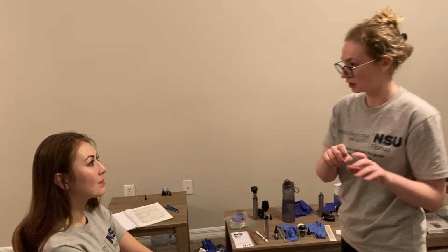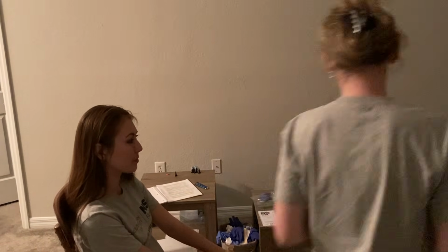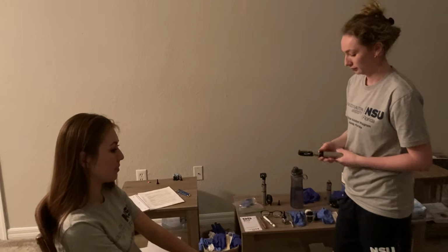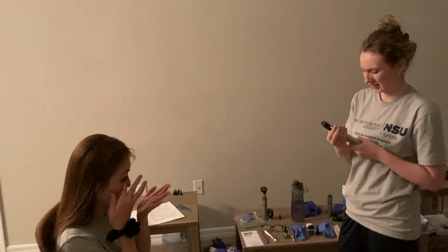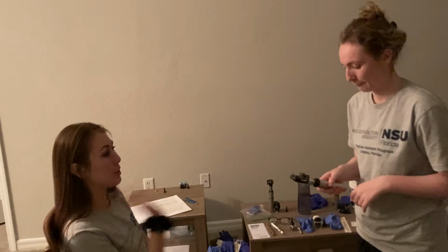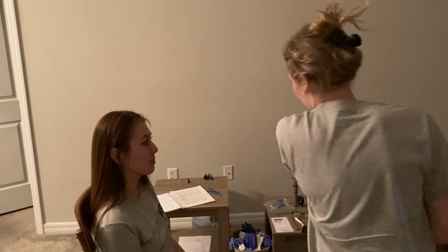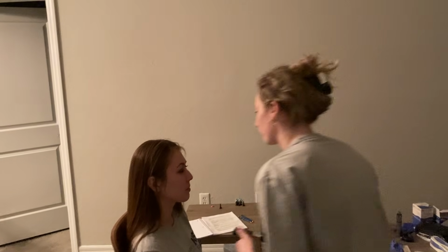I'm going to turn down the lights real quick. Okay, I'm going to remove my glasses. My contacts are really dry. I'm sorry, I should have taken them out. It's okay, don't worry. If I blink a lot, sorry. You can blink as much as you want. I'm going to have you keep staring at that window pane, okay? All right. So I have turned my diopter to 0.